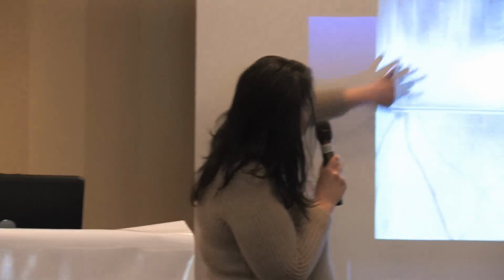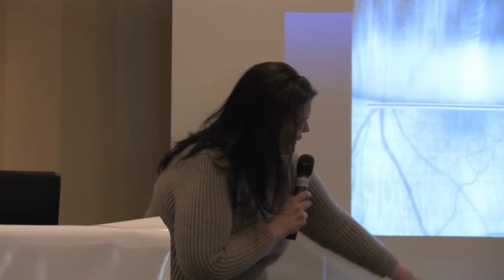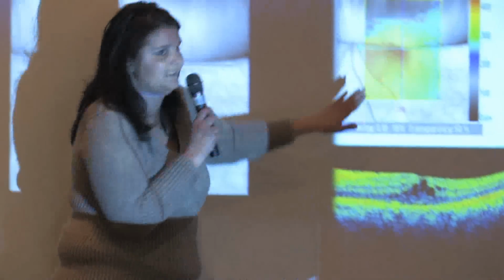This is a patient who had a gas bubble after retinal detachment surgery. This is the bubble. Gas rises. This is the scan pattern. We can move the scan down so we can still get a good scan. This is the bubble here. We can always make adjustments. So really, if you think you can't hold still, just tell us. We can always make adjustments.